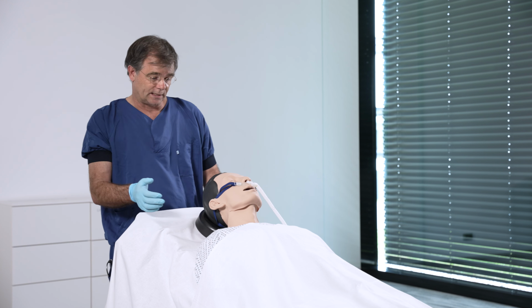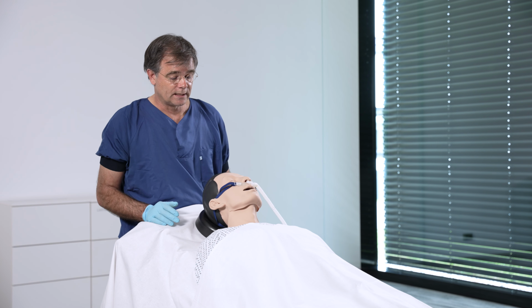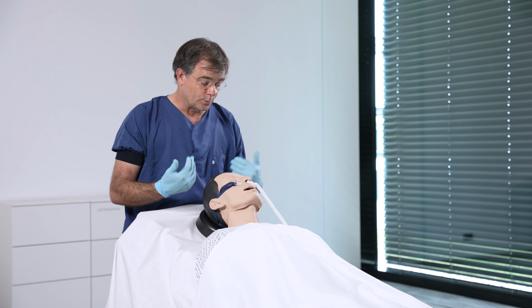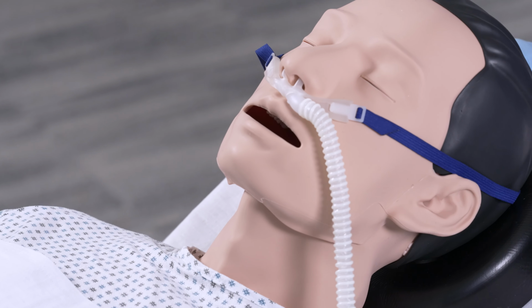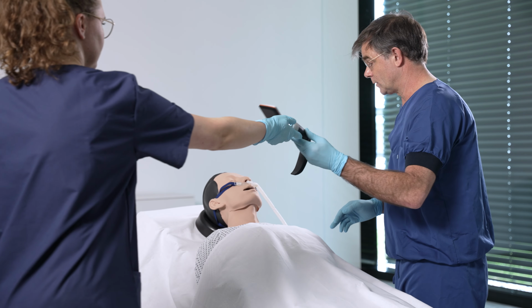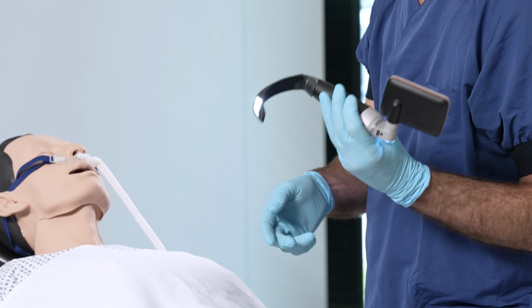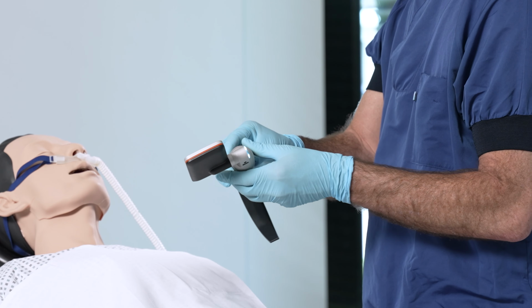So when we do this, we can topicalize the airway, we can use a bit of sedation, and when we're ready to intubate, we would instruct the patient just to breathe normally and be comfortable. And then I will take the video laryngoscope, and here we have the HEINE video laryngoscope with the HEINE 3 blade, so it's a little bit hyperangulated blade.